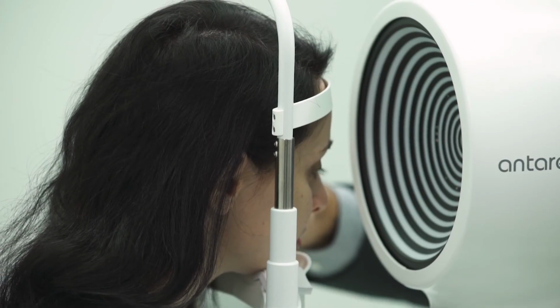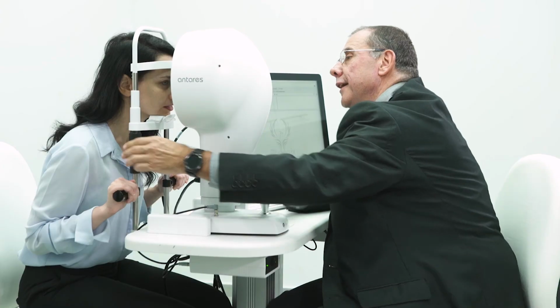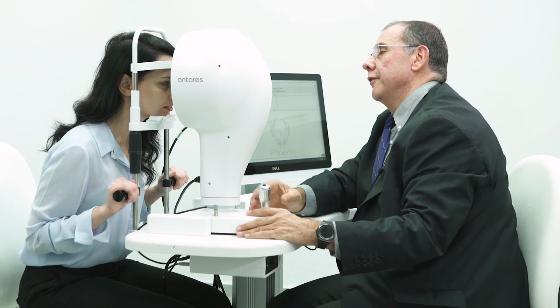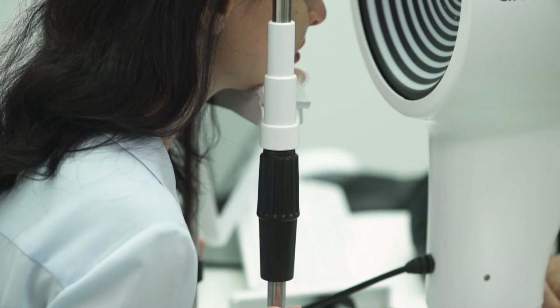On the side that I have here, there is a line that I'm going to try to line up the canthus of the eye with, and that will give us the ability to have the correct movement for the machine. And we're adjusting the chin rest with this control on the side.